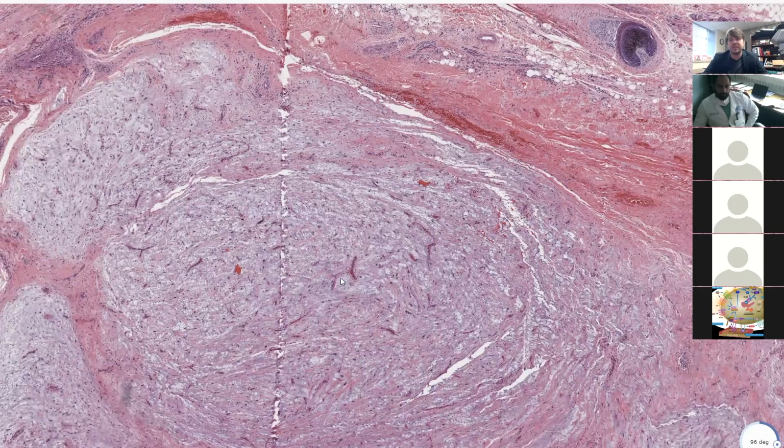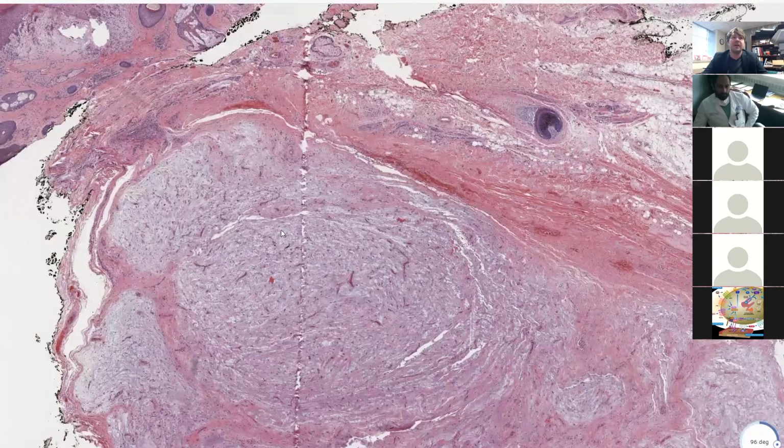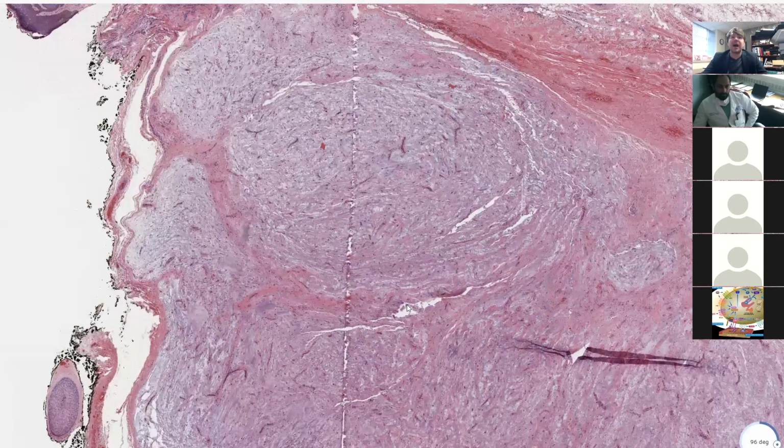It's almost always a deep soft tissue tumor. There have been rare reports in the subcutis. I've seen many, many myxoid liposarcomas. Never have I seen one in the skin or subcutis. So it may happen, but it's very, very rare. Okay, so that's not what this lesion is.